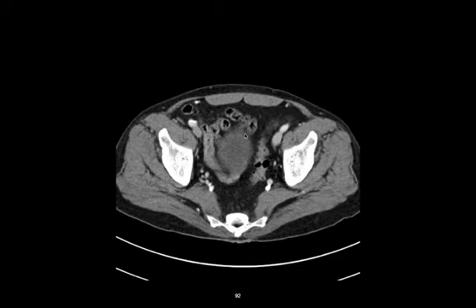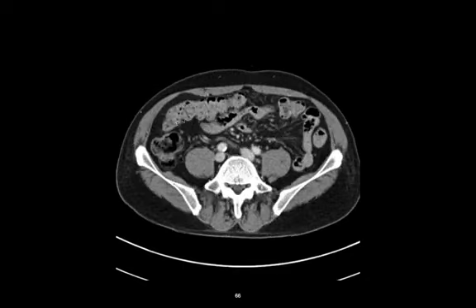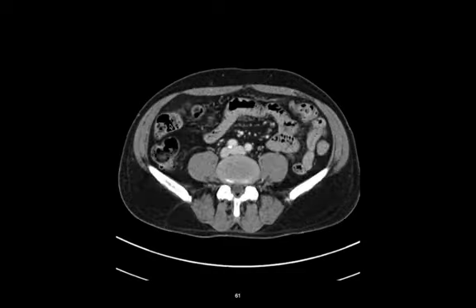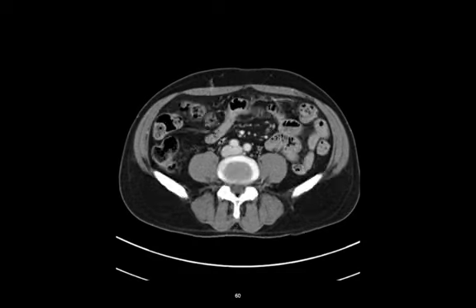Oh, and I meant to talk about the intestines. When you see big air bubbles like this, the bigger air bubbles are going to be inside. That's a big belch waiting to happen. But when we get down, this is showing intestines.